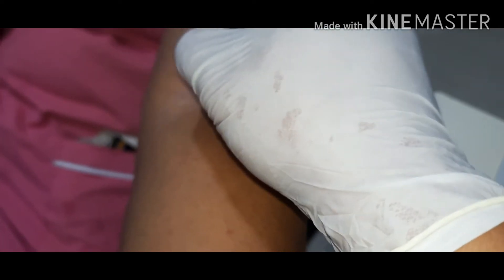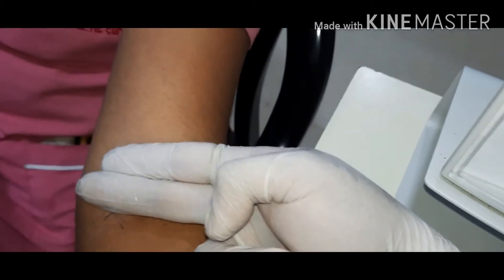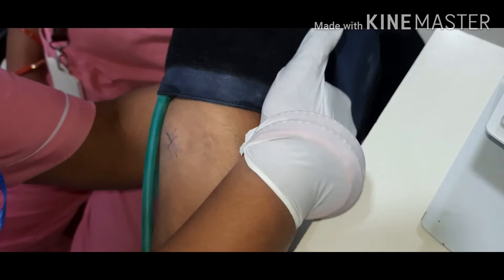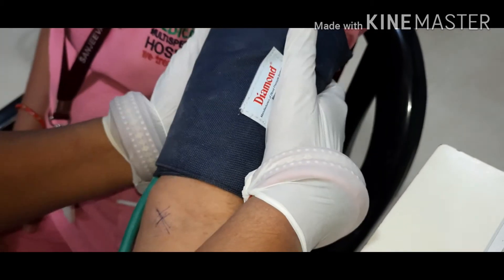Once you identify the pulsation place, then above two fingers of the pulsation mark, you just tie the cuff tightly.